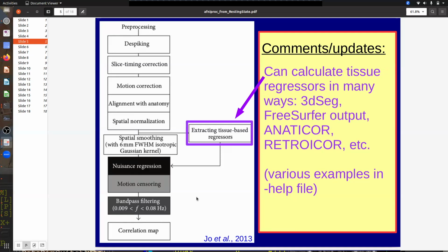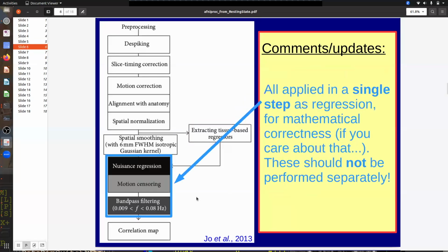But you have to remember that you have blood oxygenation response related to things like breathing, heart rate. Those are very hard to turn off in the scanner, right? Or you don't want to volunteer for that study. There's all sorts of other things that you want to try to pull out of your data. So you're focused on that idealized, or as close to what you think is the idealized, response to neuronal firing. So these are acronyms that you may or may not be familiar with, but that's what they're trying to do.